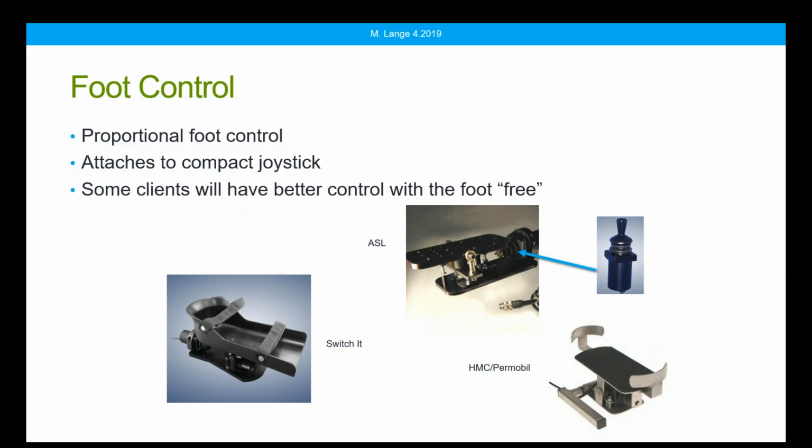One thing to keep in mind, though, is the few clients out there who can successfully drive with their foot may use their own unique pattern of movement to control a joystick, and it doesn't always match the pattern of movement required by these products here. I've only recommended foot control a couple times in my career over more than 30 years, and each of those times the client simply placed their foot on top of the joystick directly. We had to mount it down by the foot. We didn't use one of these particular products because the client had their own, again, pattern of movement.